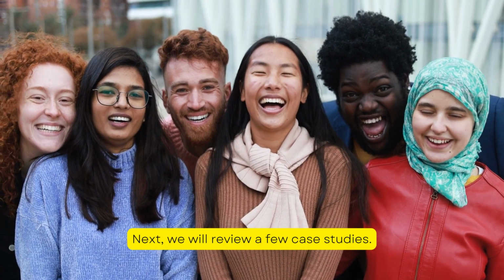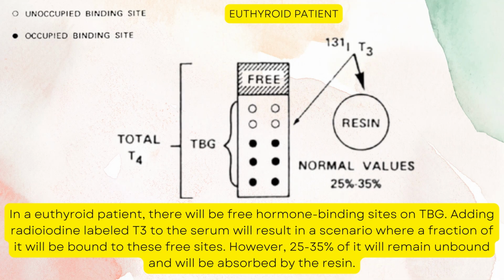Next, we will review a few case studies. In this case, a euthyroid patient. In a euthyroid patient, there will be free hormone-binding sites on TBG, or thyroxine-binding globulin. Therefore, adding radioiodine-labeled T3 to the serum will result in a scenario where a fraction of it will be bound to these free sites. However, 25 to 35% of it will remain unbound and will be absorbed by the resin. Thus, the radioactivity on the resin will be measured to arrive at the T3 resin uptake value.